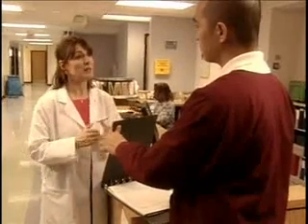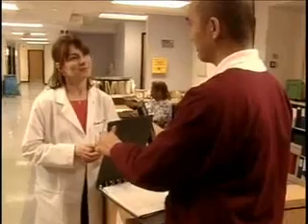I'm doing all right. I've got a patient that needs her administration tubing changed today and her current bag of IV solution in an hour, so I'm keeping track of time. Very good. Why does the tubing need to be changed? Well, doesn't that prevent development of complications from contamination? That's right. Why don't we take a look at how to change the solution and the administration set at the same time? Sounds good.